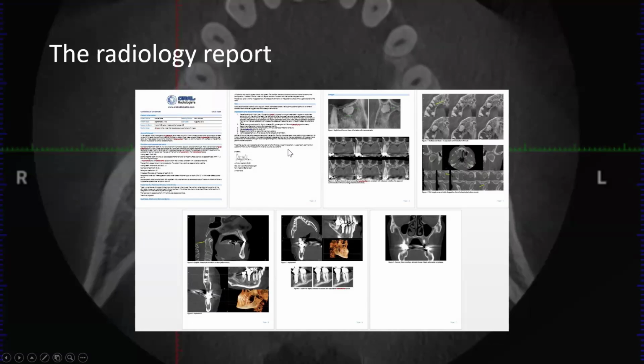You could print out the report, and that'll be more detailed about where I see the calcifications, maybe how dense those calcifications are. These will also include images. This is where I probably go overboard too, way too many images. Now, let's see, it looks like I wasn't doing it here in this example report. Now I always start with a panoramic reconstruct.